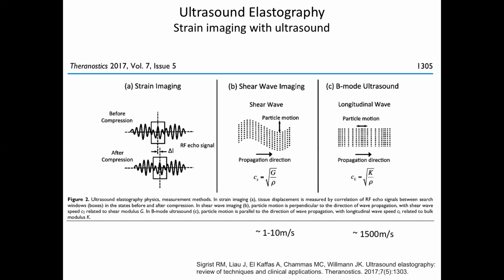So there are many ways of doing this, in the sense that there are many ways of applying the strain to the tissue, right? One is just take ultrasonography, and the expanding vessels will deform the tissue.